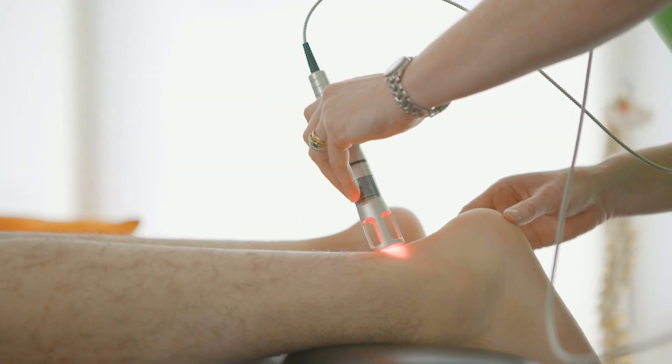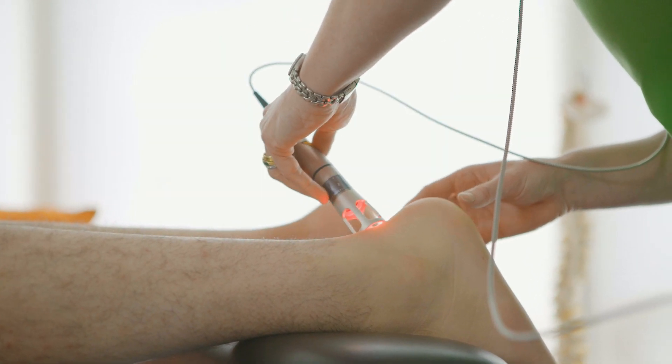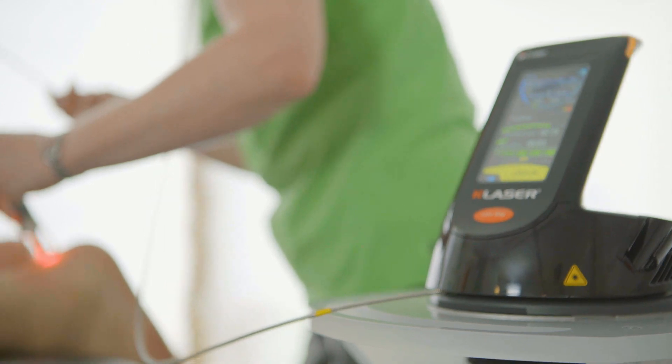We would correct all of that for them, but the person is still not using their elbow properly and therefore not stimulating the cells in their elbow to heal. The K laser stimulates the deep capillary beds of your elbow, introducing more oxygen and ATP into the area — ATP being the cell's energy, like diesel to a diesel car — so natural healing is stronger and quicker. We correct it biomechanically, and the laser corrects it cellularly.